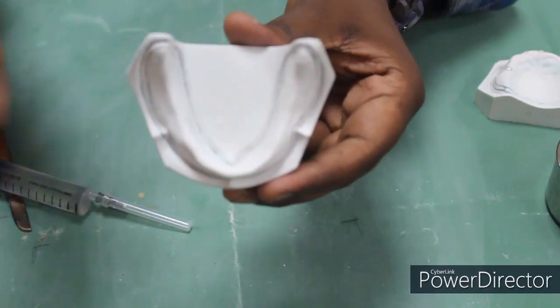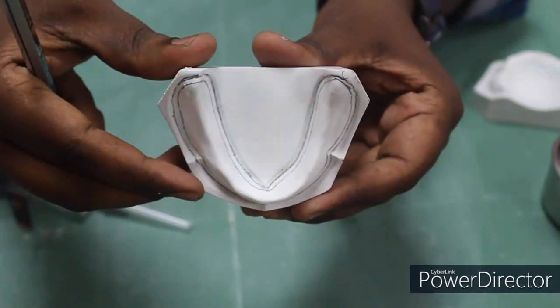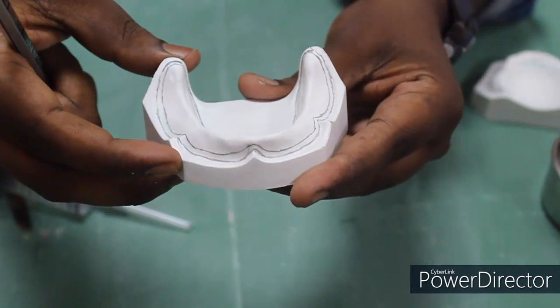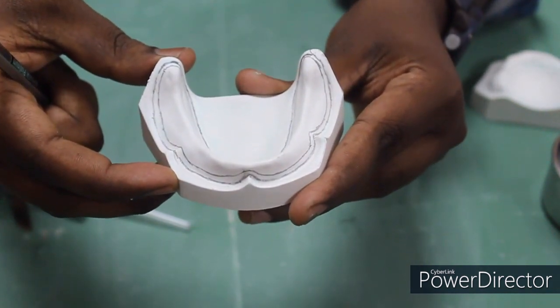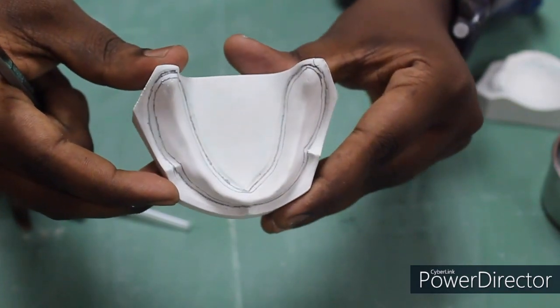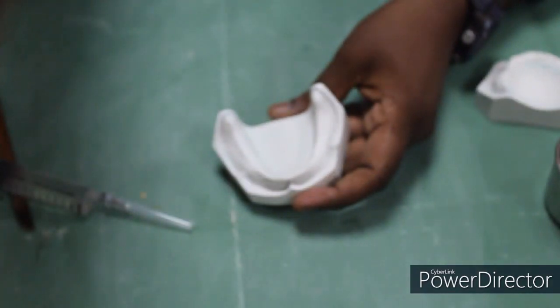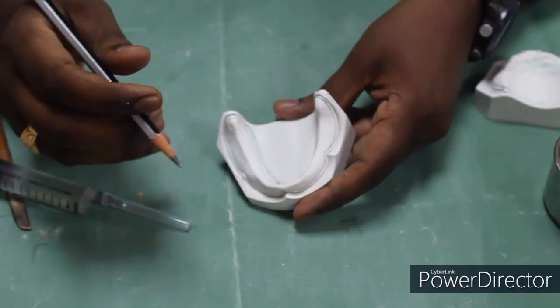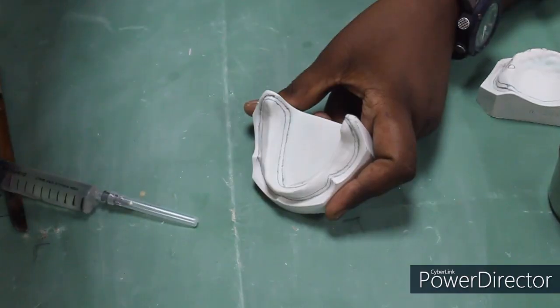So we have drawn 2 lines. Now you can see the lingual aspect and also the labial and buccal aspect. The first one is the depth of sulcus and the second is the tray line. This is the proposed tray line for this case. Third, we are going to draw the spacer outline.